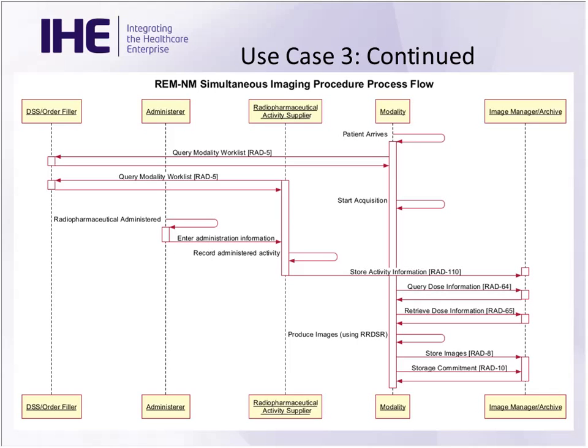The modality goes ahead and proceeds to acquire the images, and then stores the images, and then when processing, it queries and gets the dose information that the RAS has stored, and when the images are reviewed, it changes the headers and adds in the activity for processing.